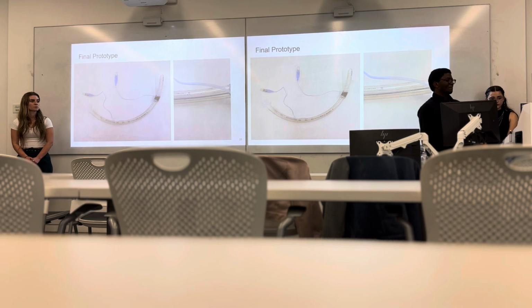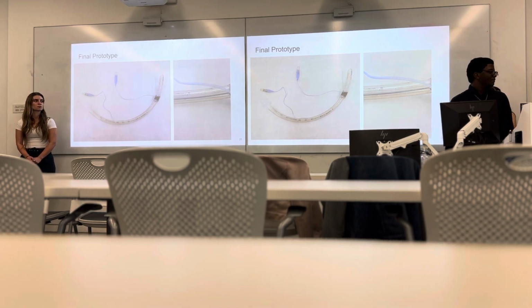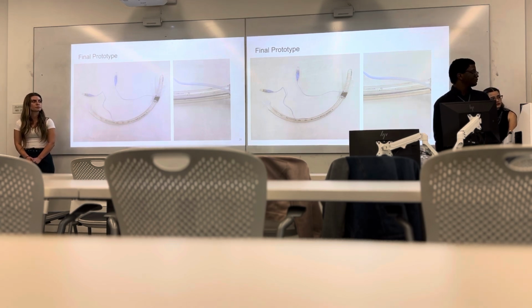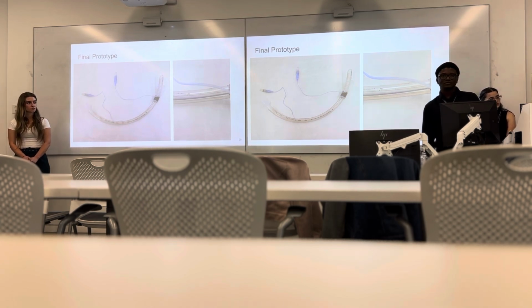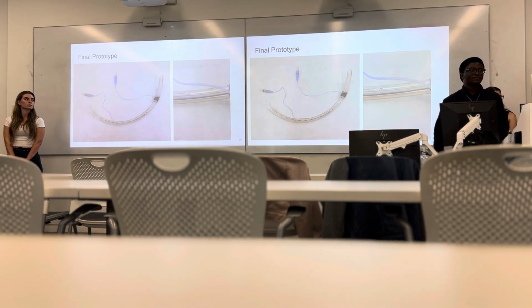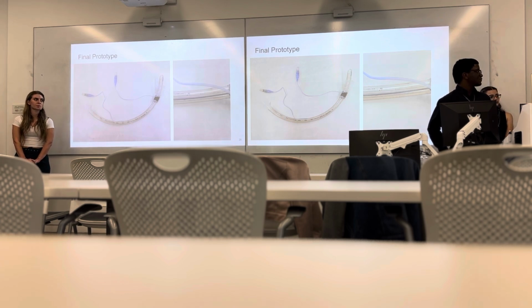All right, so this is our final prototype. We were able to add that second catheter to support giving the medication. We also used that same CNC machine to poke the 5 holes that we got from the alpha prototype, and have that catheter line still going to the cuff to be able to blow it up. And like Abofu said, it's only moved 90 degrees over.